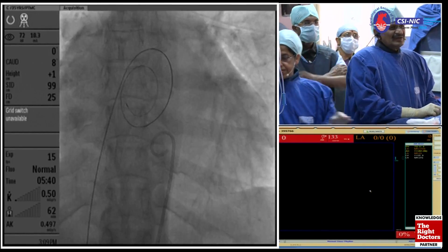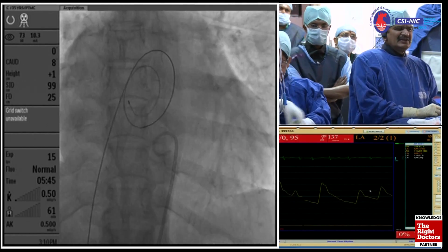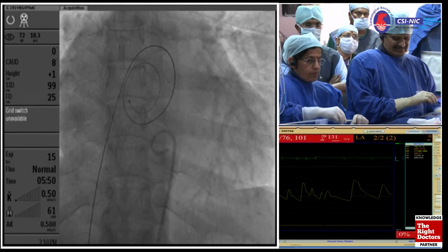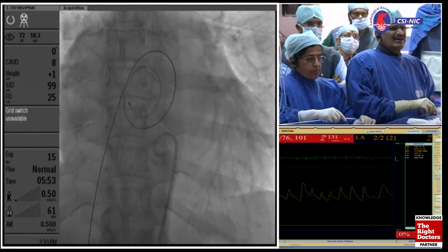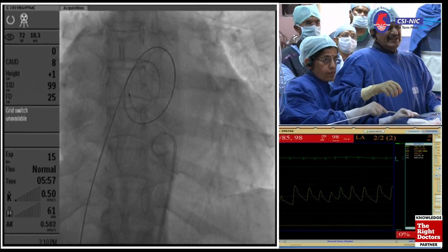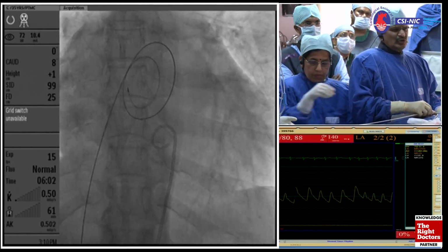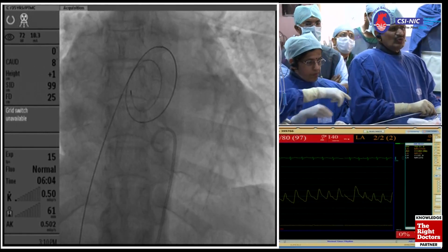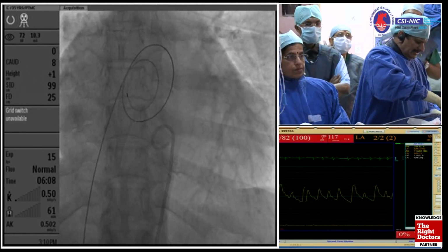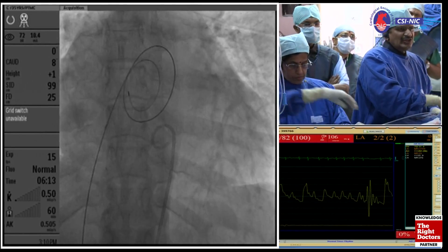So what are going to be the special steps? Another important thing is you have to always keep an eye on the left atrium to avoid the clot. Since it is an appendage clot, I am just doing it routinely. Otherwise, if the clot were in the roof, we would have done the over-the-wire technique, where we introduce the spring guide wire into the LV itself instead of the LA.